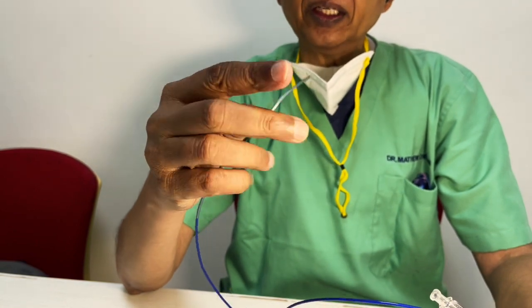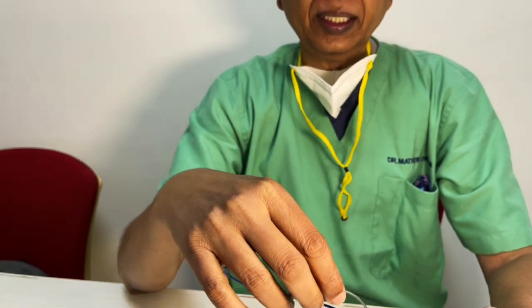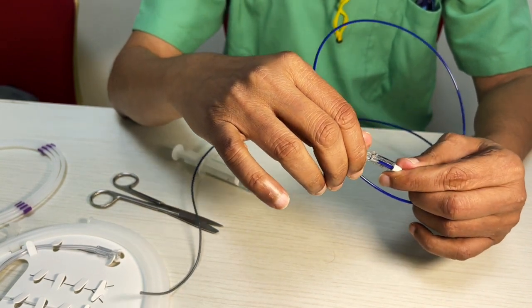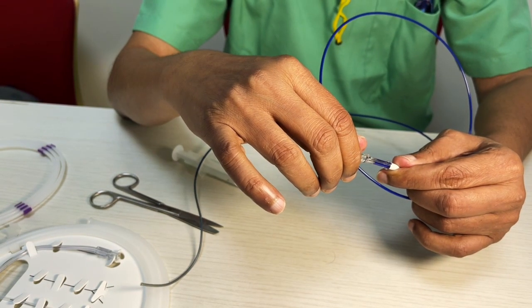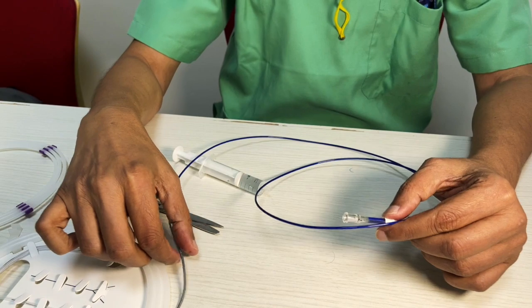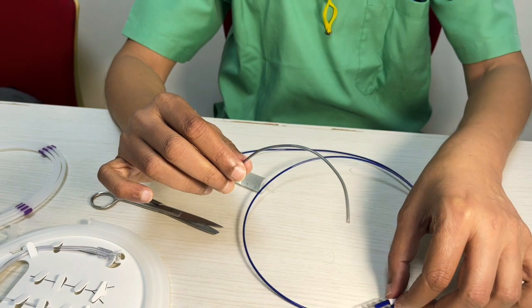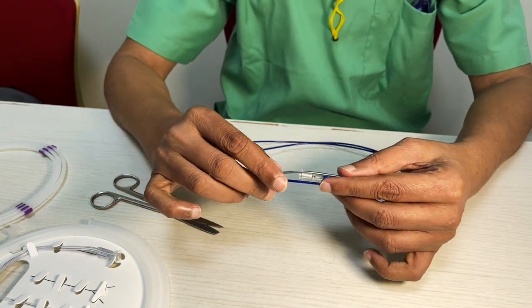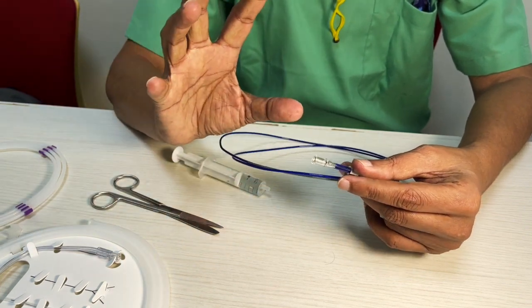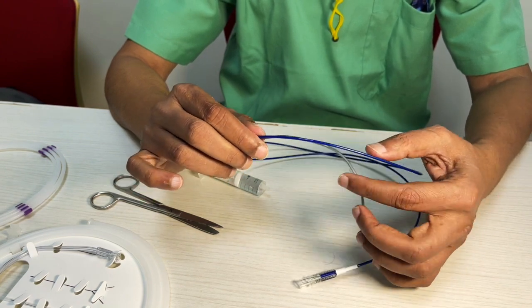So when you take this catheter, remember the lengths. The lengths of all these catheters are much longer than the conventional DAC catheters because they are meant for suction. This is a Cat 7 068, 132 centimeters long. So remember, when you're using a Y connector, you lose another 5 to 6 centimeters. Today companies have started bringing longer microcatheters also, catheters which are longer than 150, which will give you the distal access that you need. So hope you got some idea about how the distal access catheters and the aspiration catheters are constructed.